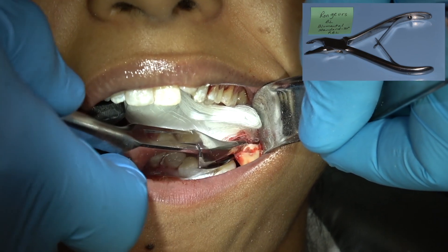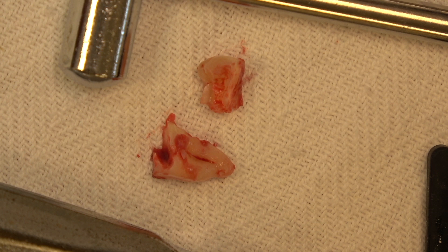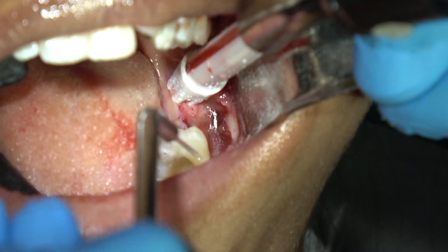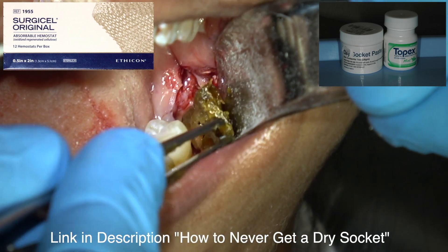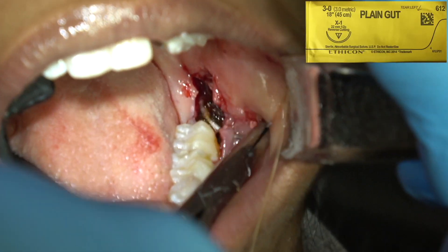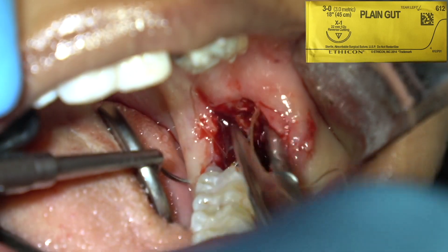Here's the crown and here are the roots — you can see the hole I drilled into the root to elevate it forward. Irrigate that out and take your rongeurs to be sure there's no follicular sac in there. Then pack the socket — this is the key to not getting a dry socket — and suture it with 3-0 gut suture.